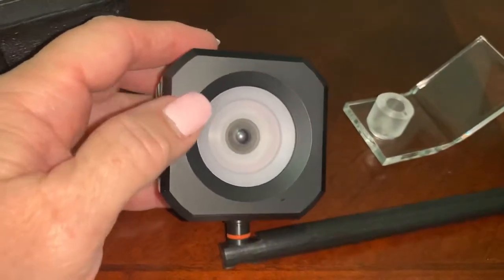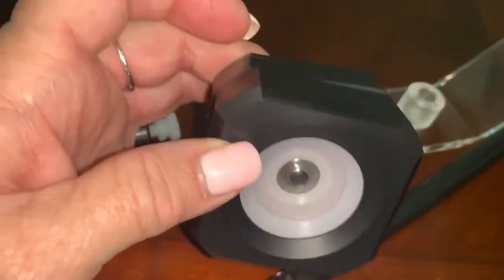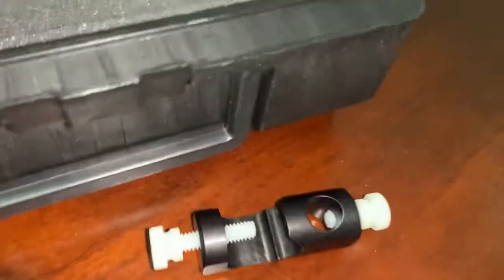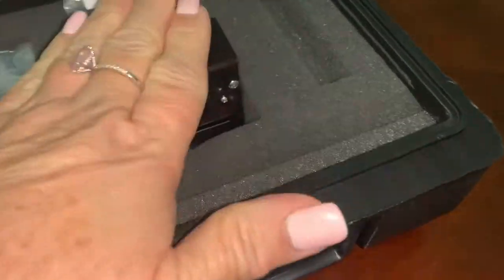Super simple. You can use this as a right eye or a left eye. You can pivot it within the hole if you want to change the angle of it. I always store these eye-side down so they stay perfect.